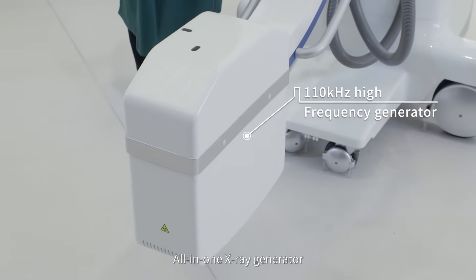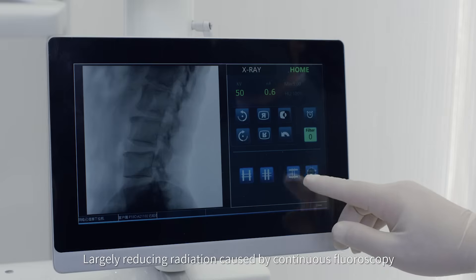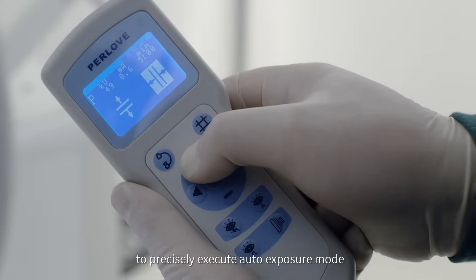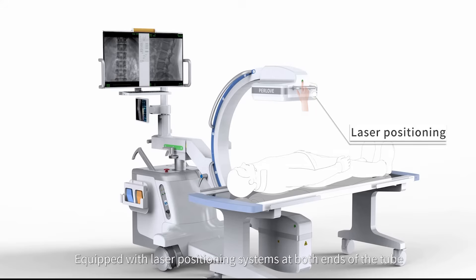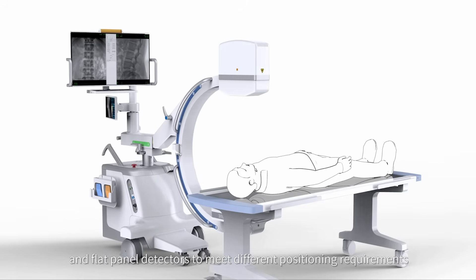Only one X-ray generator, largely reducing radiation caused by continuous fluoroscopy, while automatically adjusting the region of interest to precisely execute auto exposure mode. Equipped with laser positioning systems at both ends of the tube and flat panel detectors to meet different positioning requirements.